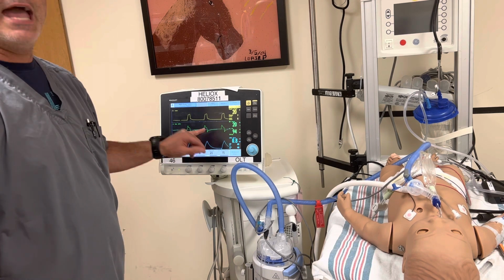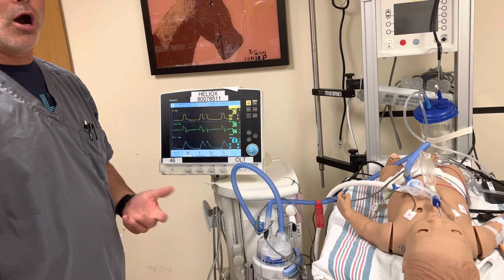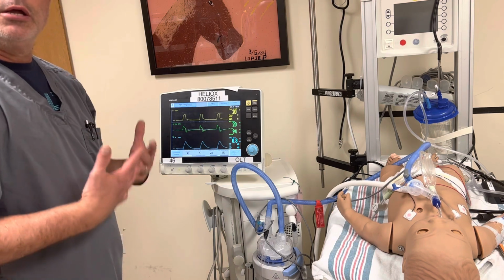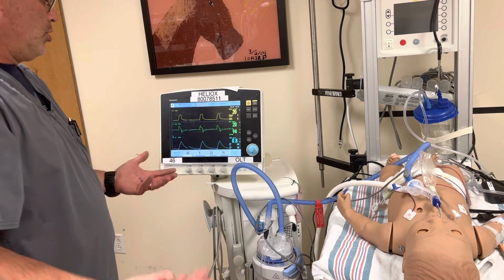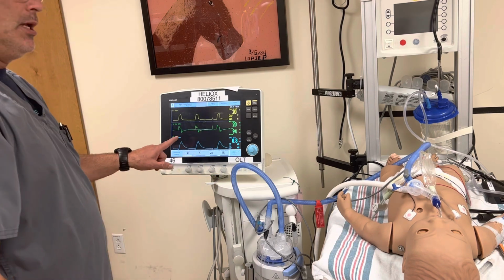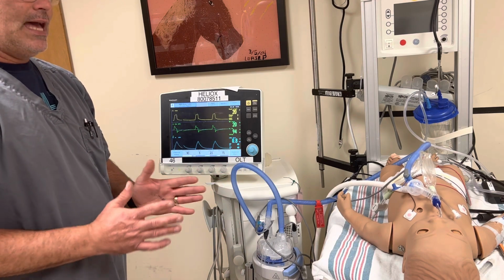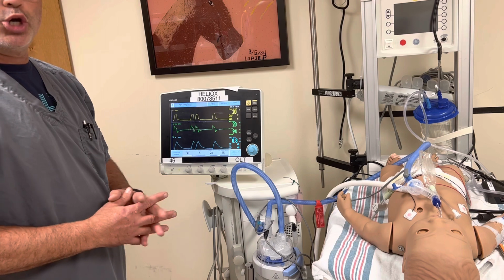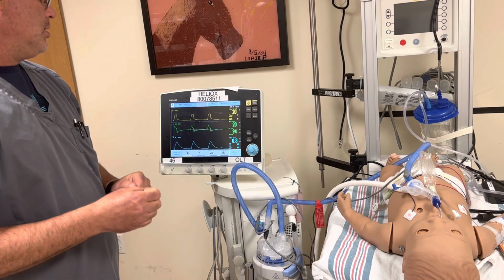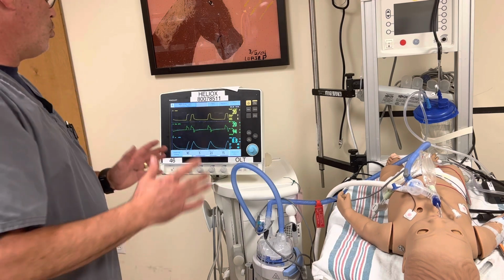If they're looking for expiratory flow coming back to 0, they're going to refer to that as, is there any air trapping or auto PEEP? Okay, so the first setting we change after we enter our ordered settings, or the first settings we have a policy to adjust on our own, is the I time. So based on the patient's size, you have a set time frame you could work within. So a toddler, you can work within 0.4 or 0.6 and 1 second, for instance, right? So 1 second.